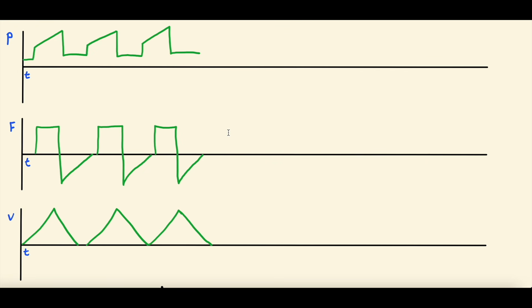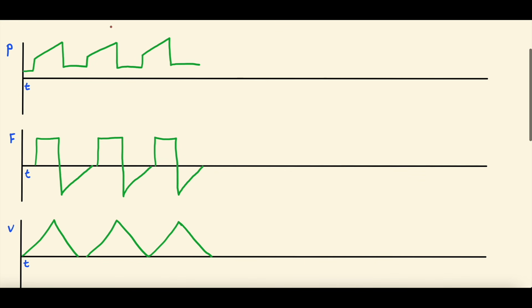So what is flow starvation? To start, we have three different waveforms here. Of note, we're going to be talking about flow starvation from the ventilator settings of volume control. So VC, AC is how it's set on some vents, but volume control rather than pressure control, meaning you set the volume the patient is going to receive. And what volume control normal scalars or waveforms look like are set right here and drawn out.